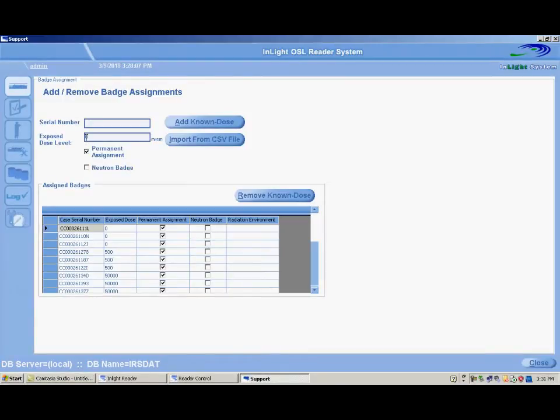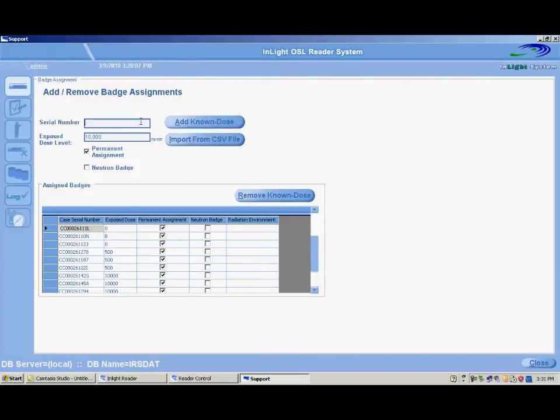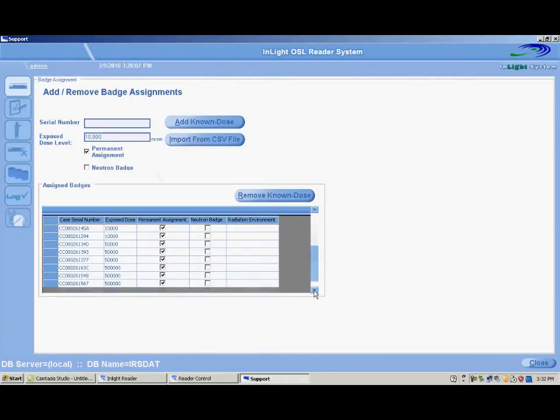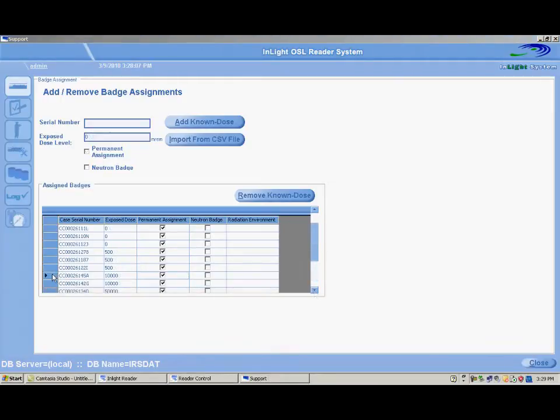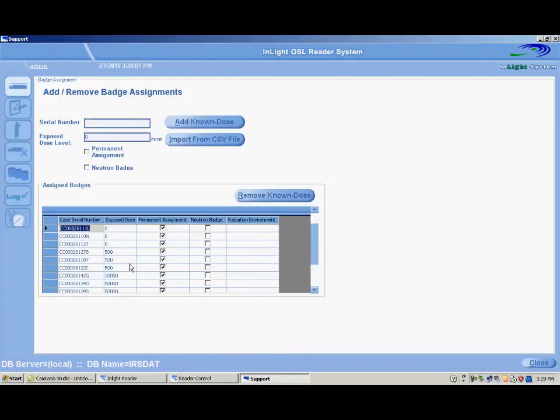Enter the dose value, always in millirem or millisievert depending on the units of measure you have selected. Type or scan the serial number and click the Add Known Dosed button. Each time the button is clicked, the dosimeter is added to the list and removed from the text box. To remove doses, highlight the row of the dosimeter in the list, then click the Remove Known Dosed button.